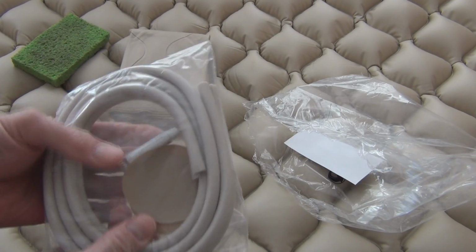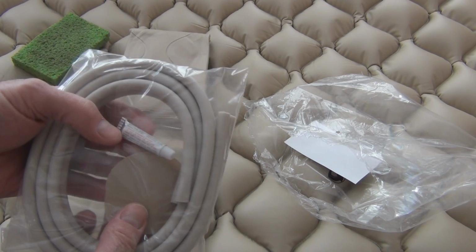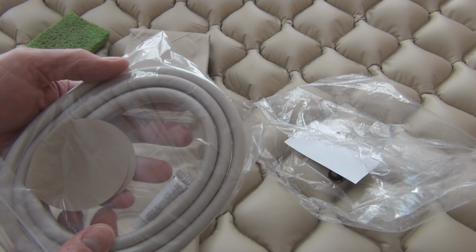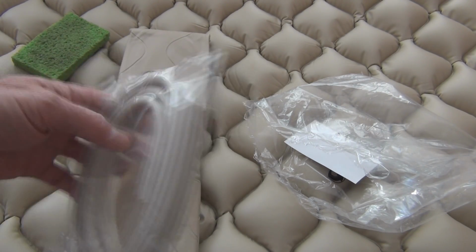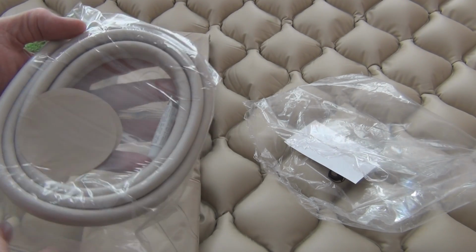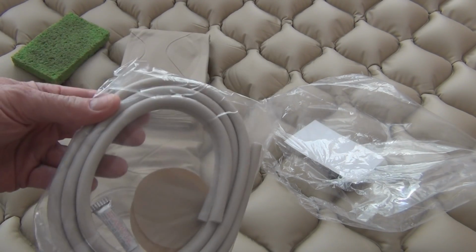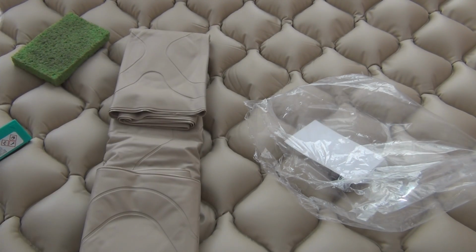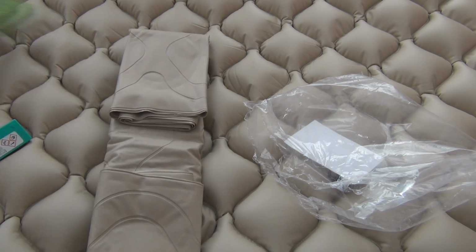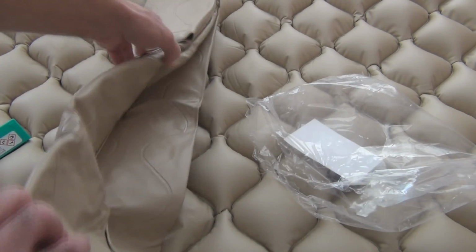And yep, so this one actually has a patch kit in it also. I do not know what I did with that. At least I know what to look for. I must have left it in the bag. I wouldn't have used this because I've got the old tubing. So I'll have to look around for that, see where it is. So here's the mattress. Just going to be the exact same thing.